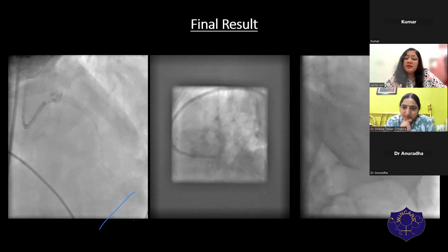So for me, I still do a lot of ostial LAD placement, although the popular belief is now that you go from left main to LAD, you're able to prep better. But for me, with a dominant circumflex with a distal circumflex lesion, which I might need to intervene in the future, I would have had to go through the left main to LAD stent, and I would have had to distort it. So for me, leaving that opening of the circ free from the future intervention, if required.